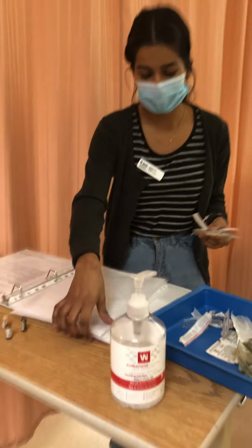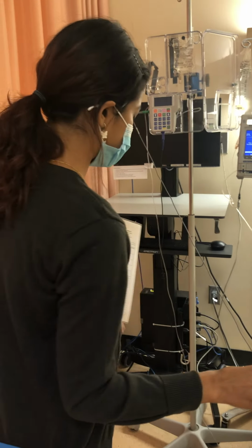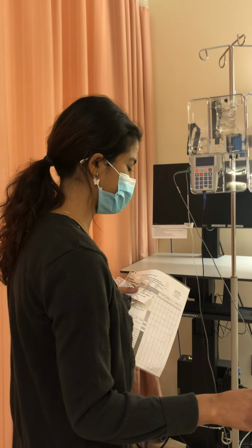So I've gotten all my supplies. I'm going to take my MAR and my mini bag, my label, go over to the bedside, do my hand hygiene, and an environmental safety check. Patient's bed has been lowered to the ground, call bell is in their reach, and patient is in a comfortable position.